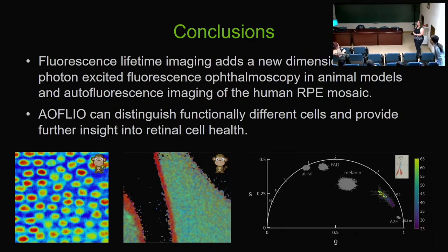So you said that with different pathologies, you saw a shift in the fluorescence lifetime, but that was for different pathologies, right? And my question is, is it always the same shift? Because for different pathologies, the fluorophores that change should be different, right? Absolutely, absolutely. So what's the shift and where's it coming from? And that is the next direction.